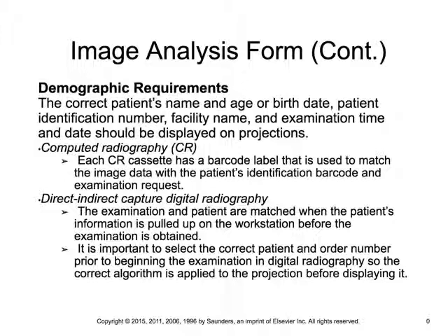So, demographic requirements, as we mentioned before, we want to make sure that we've included the patient name, that it's correct before we send it to PACS, so that the numbers are correct. Every now and then different PACS systems kick out funny numbers and stuff. We want to make sure we do all of that before we send it, because again, that can save us some time and make sure that there's no overlap.